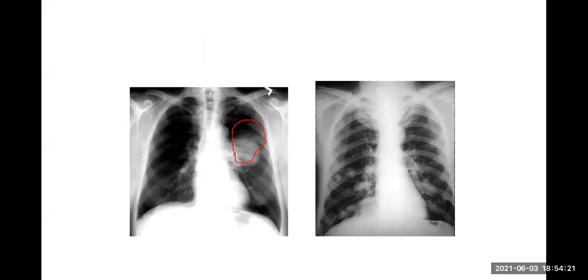On the X-ray on your right hand side, you see many of these nodules. Multiple nodules. So this is called a cannonball deposit metastasis. So single nodule, multiple nodules.